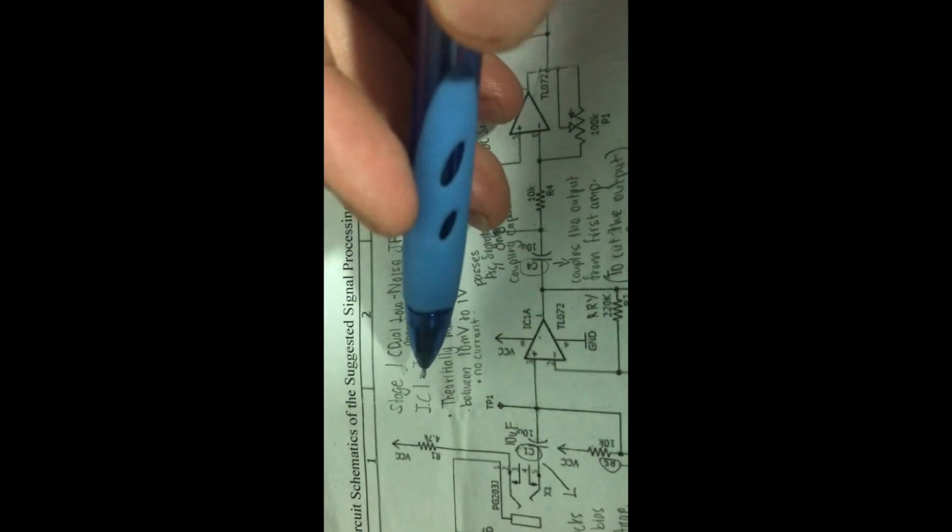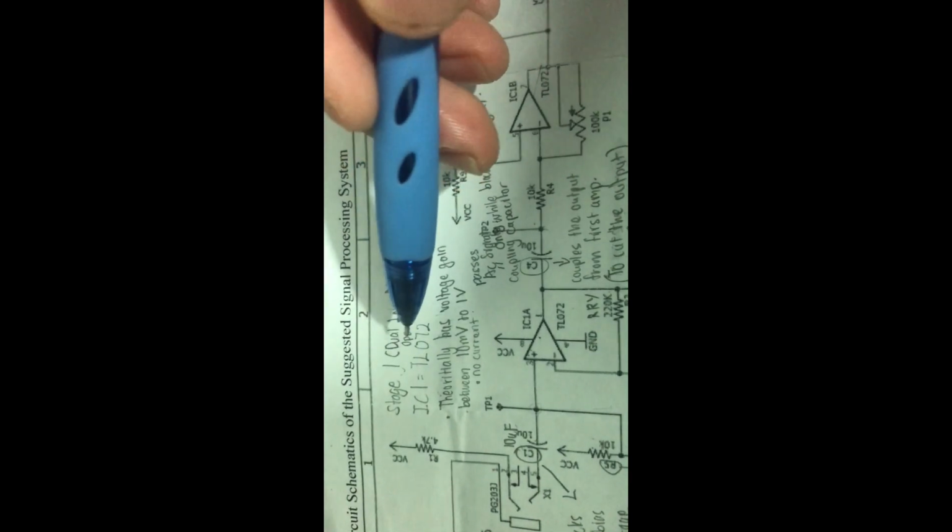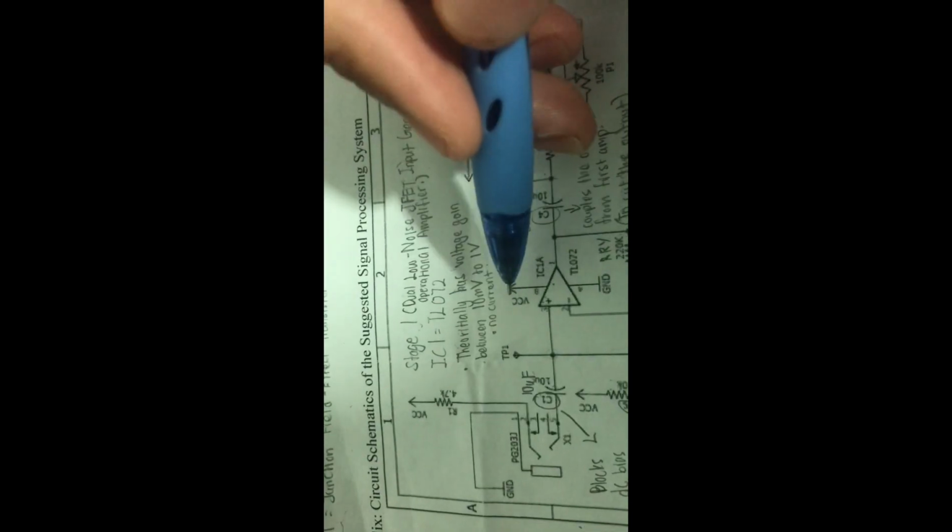So I am demonstrating here stage 1, theoretically explaining what we are looking at. Stage 1 is up to this point before TP2. Stage 1 is a dual low noise JFET input general purpose operational amplifier, which is built with IC1, which is TL072, which theoretically has voltage gain between 10 millivolts and 1 volt, but no current. For those who don't know, JFET is junction field effect transistor. The op-amp amplifies sound where subtle shades in the character of sound can be added or subtracted.